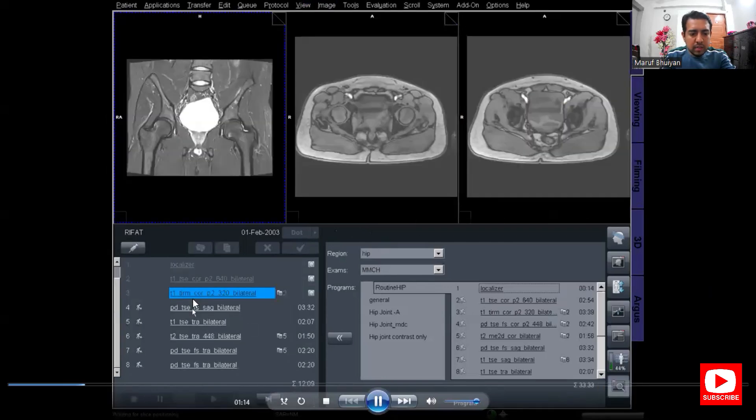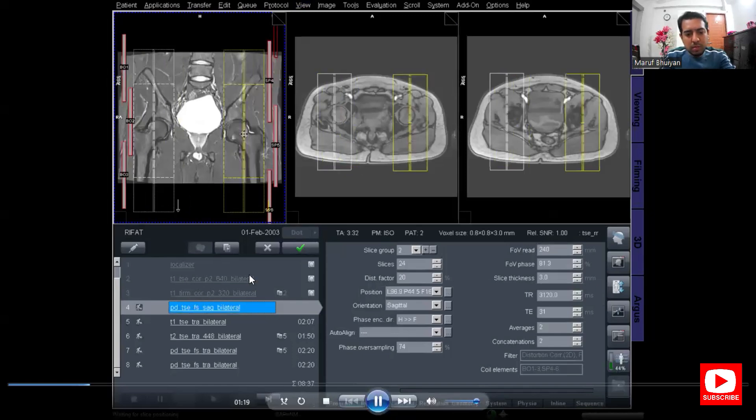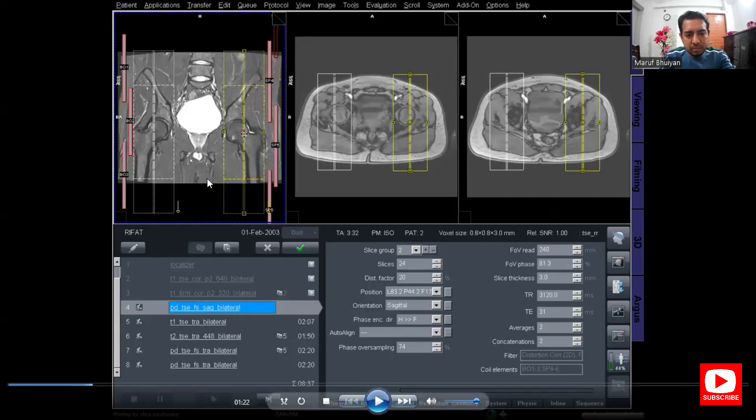I already deleted the other two coronal sequences, so only T1 coronal and T1 TIM coronal have completed the scan. Now I am planning for the sagittal images — for both right and left hip joints on a single protocol. For sagittal planning, plan on the coronal image and axial image. On the coronal image, the slices or positioning block should be parallel to the femur.